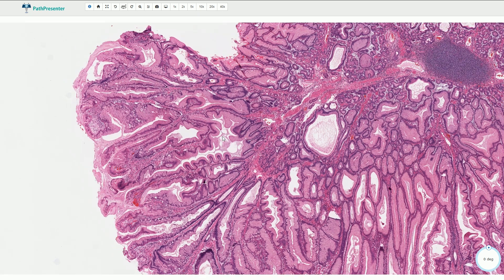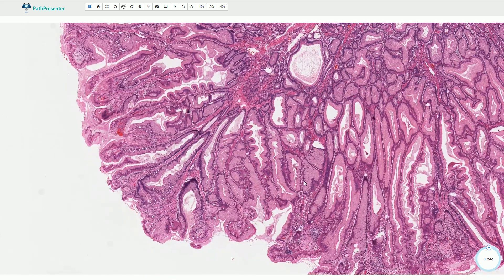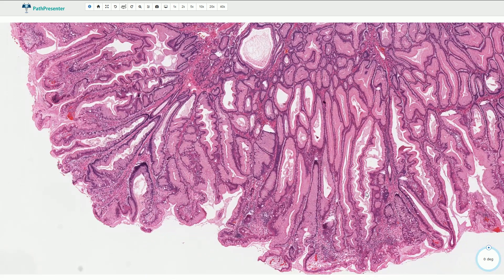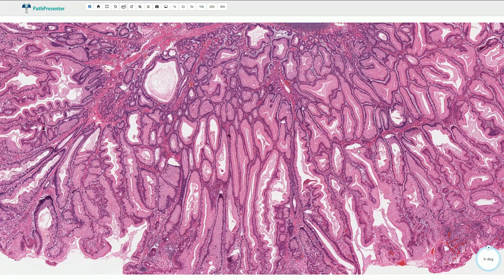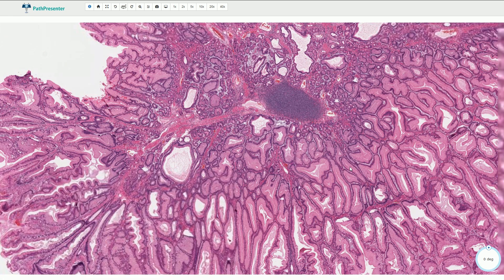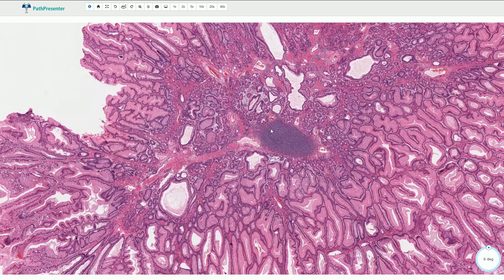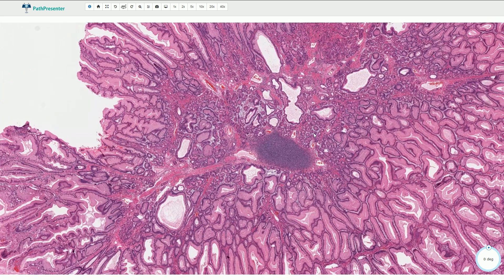These crypts can be slightly irregular; sometimes we see a serrated pattern. Peutz-Jeghers polyp is typically associated with villous or papillary architecture of the superficial crypts. It is usually not associated with dysplastic changes, but sometimes we can see them inside the polyp. In the center of the lesion, the crypts are more regular and tubular.